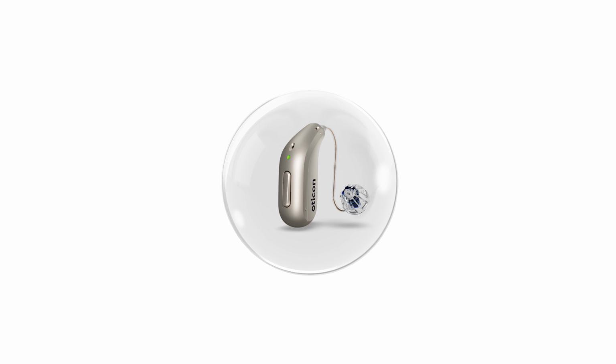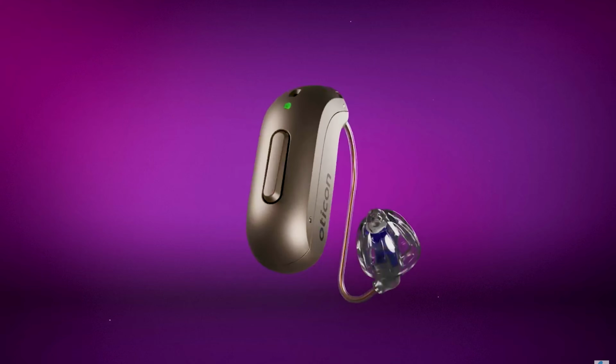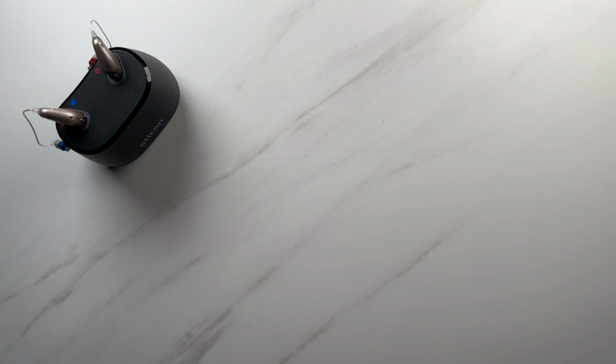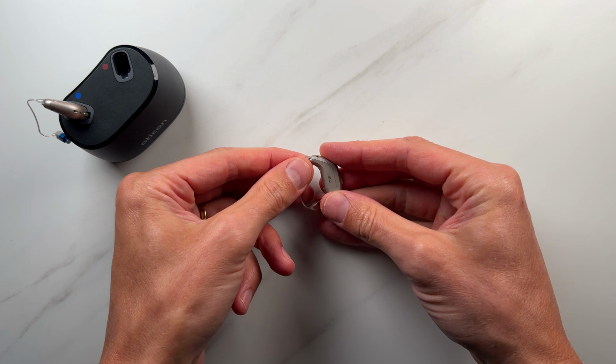So, when I heard of the pending release of the Oticon Intents, I welcomed it with open arms. What's new then? So far, the Oticon Intent is available in a single model, the Mini RITE R. Those of you with a keen eye will notice that this is the first time we've seen a redesign of Oticon's receiver in canal hearing aid for 3 generations now, going back to the Opn S Mini RITE R. So I welcome this fresh new look, which Oticon are boasting is their smallest ever rechargeable Bluetooth receiver in canal hearing aid.